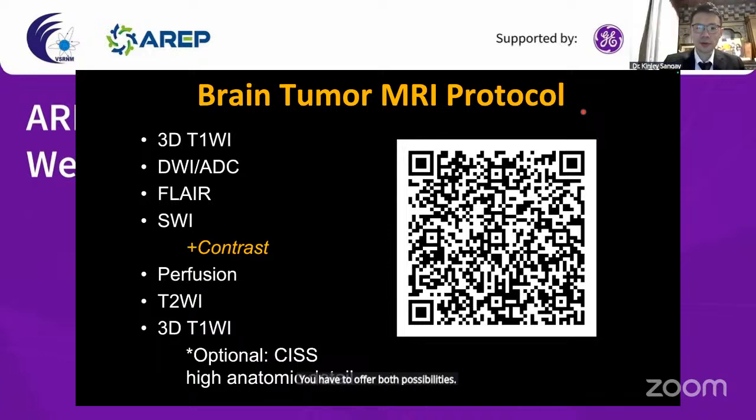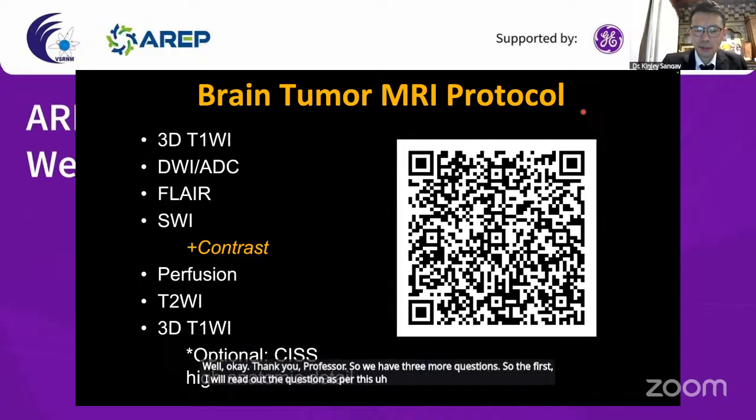Okay, thank you, Professor. So we have three more questions. So the first, I will read out the question as per this, according to the timing. So the second question is, any reason for doing the T2 sequence post-contrast?